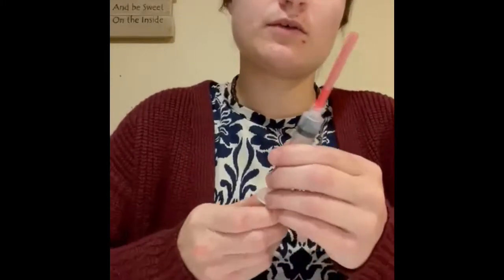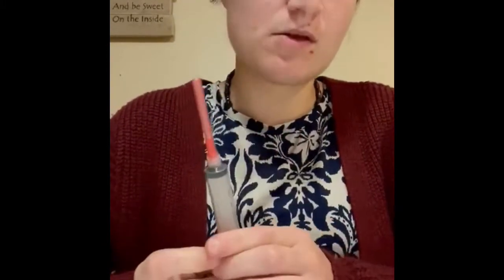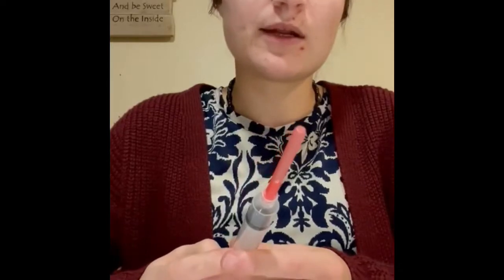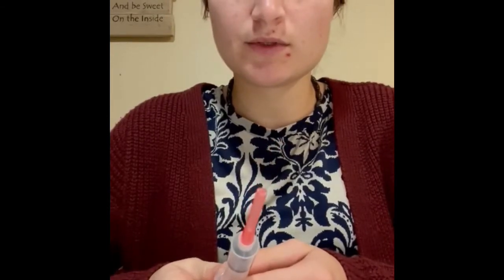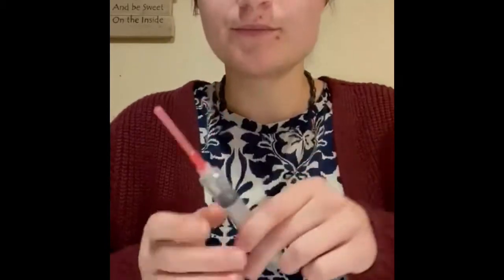I'm just going to play with the plunger a little bit here, make sure it's good. So we're going to be drawing 4 mLs, and we want to use syringes that are double the amount. So it's a 10 ml syringe, so it's good for 4 mLs.